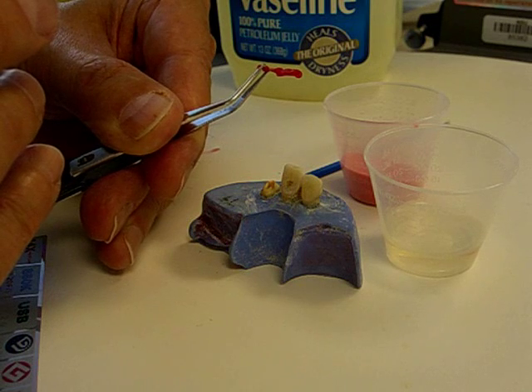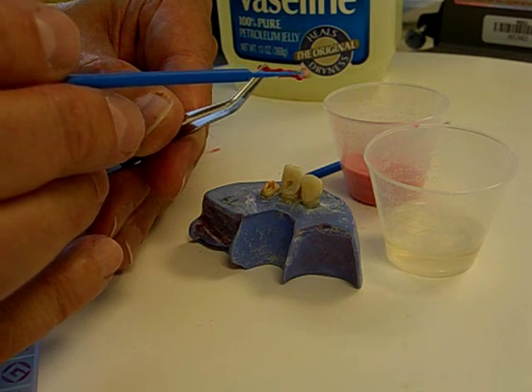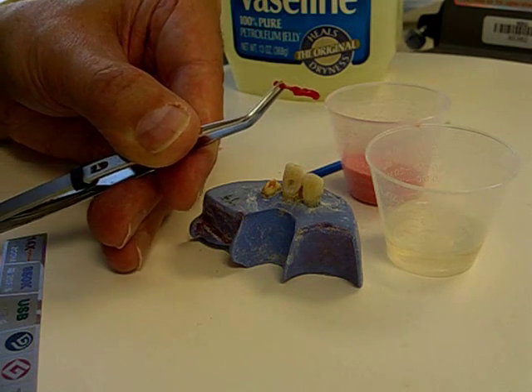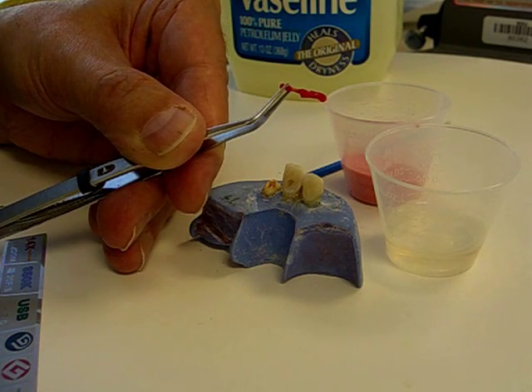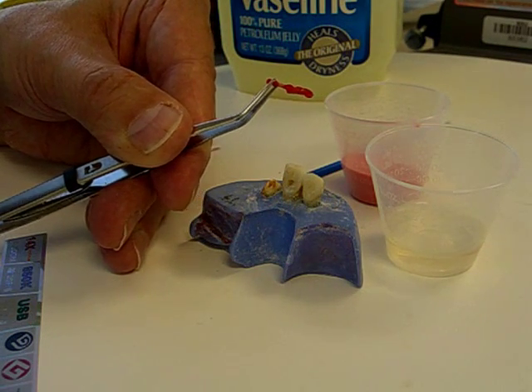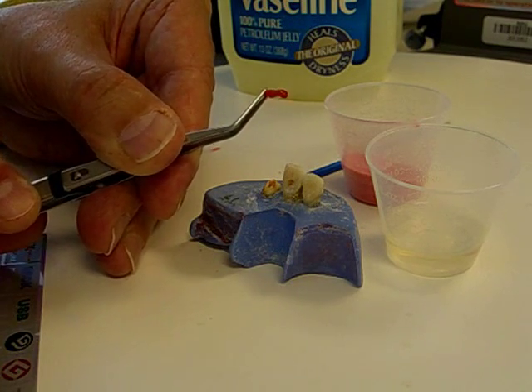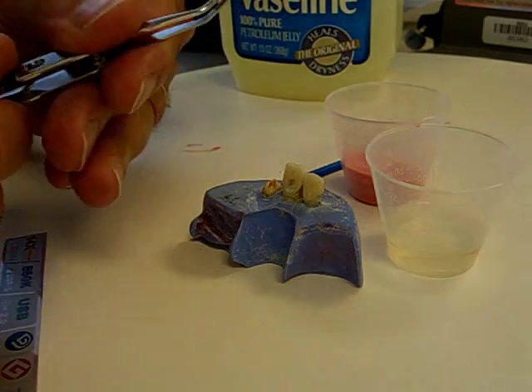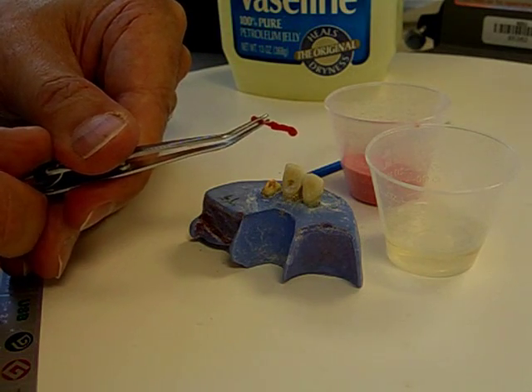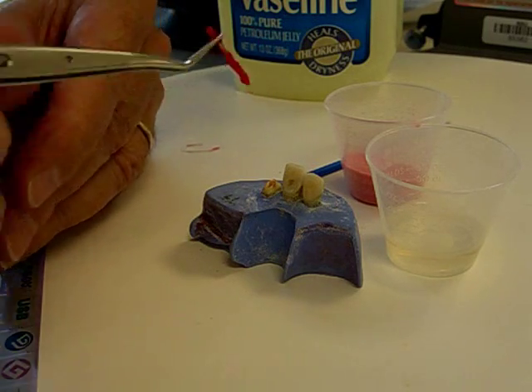I'm adding monomer and polymer to the very tip of my plastic sprue. I'll allow that to frost up now, prior to inserting it into the canal. That's just about frosted up at this point, so we'll reinsert it into the canal.